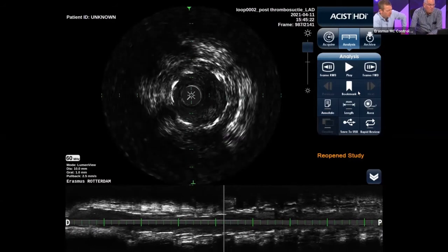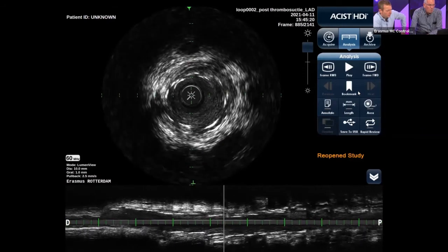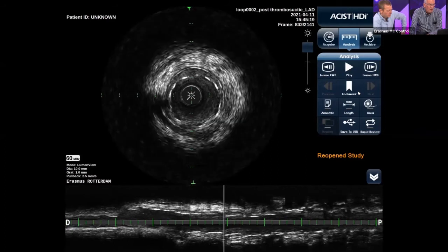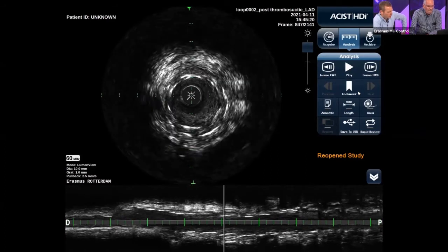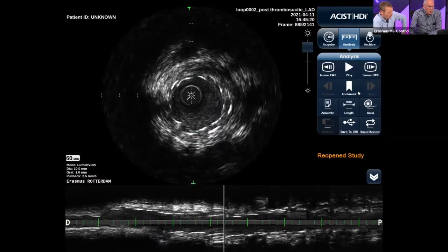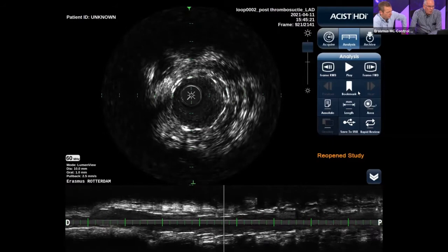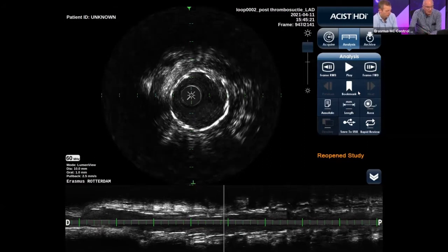You see here on the blackish spots within the artery, there is still thrombus remaining. Yeah. And it's a little bit difficult to appreciate because of the image that runs a bit slow, but I think, Jurgen, that we can conclude that that is the case in this. Yeah, what I often see is that the more organized the thrombus is, the more difficult it is to get it away, get it out.